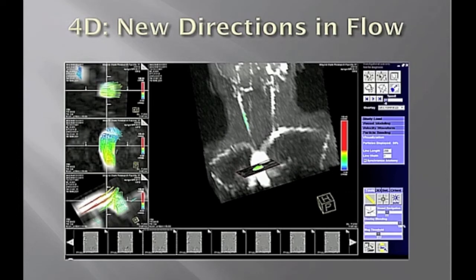Now, I really don't have much more for you in terms of what the future is for four-dimensional imaging in one slide at the moment, but we have begun evaluating some software that Siemens has made available and another group with Michael Markle from Freiburg, and this is the four-dimensional imaging. All this means is that when I do my 2D slice, it has 2 dimensions in space, 1 dimension in time. Now we could do 3 dimensions in space and 1 dimension in time. So it's really 3D, 1D.